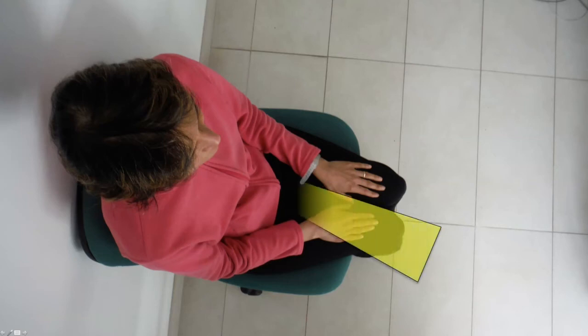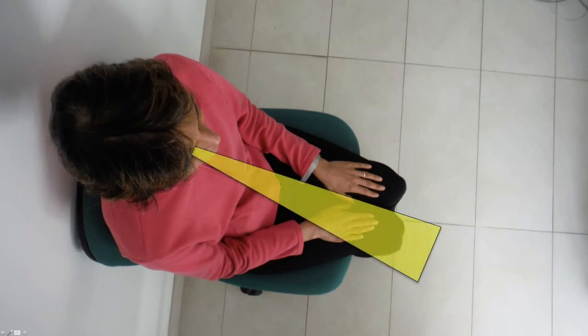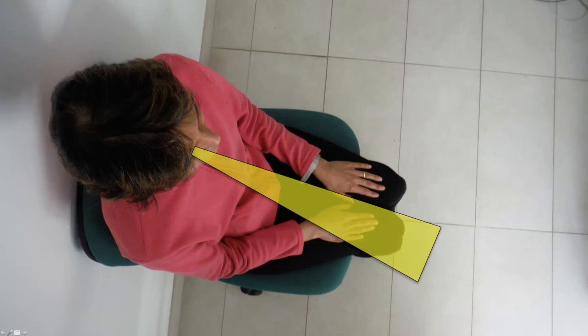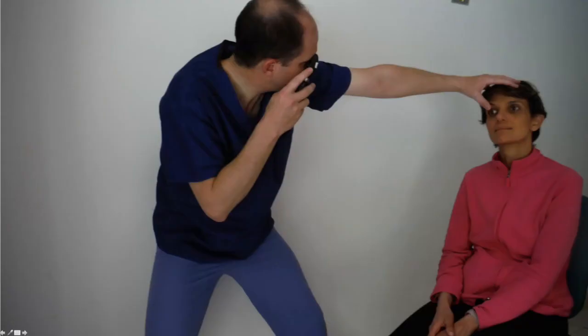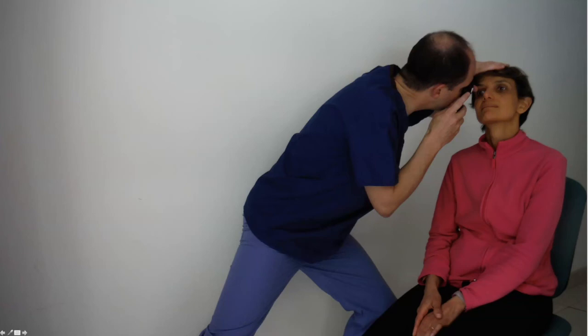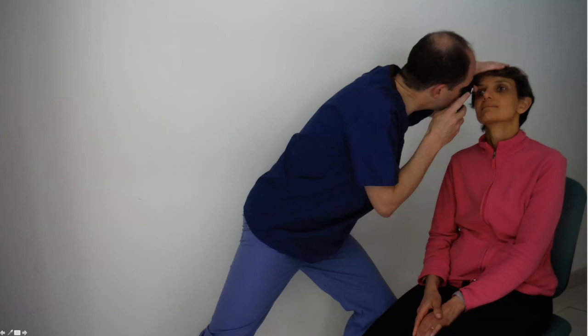Seen from on top, you can see that your flight path needs to take you down a narrow cone straight onto the patient's eye and not veer off to any other part of the head. Your movement in effect is a bit like a lunge from arm's length right up to very close to the patient. The closer you are to the patient, the more of the retina you will see at once, so you need to be as close as is decent.